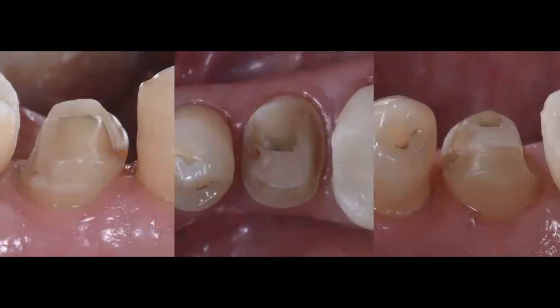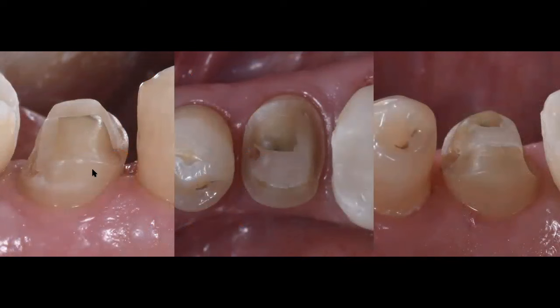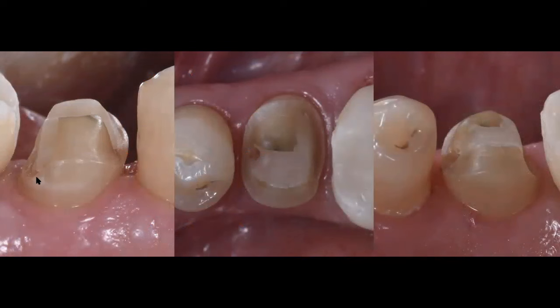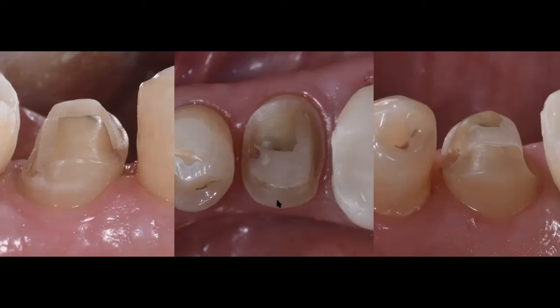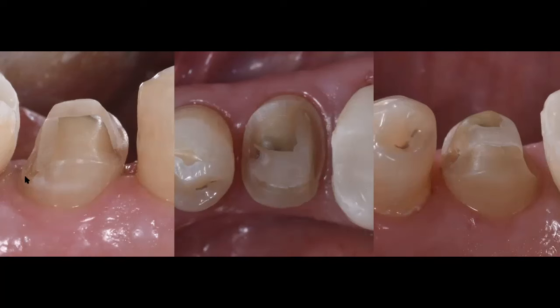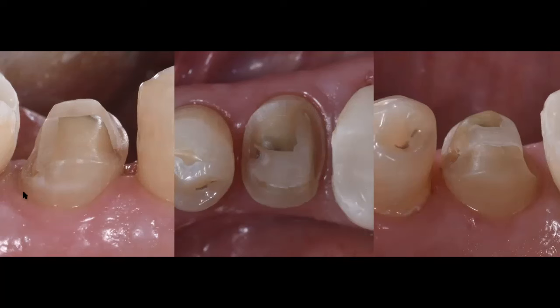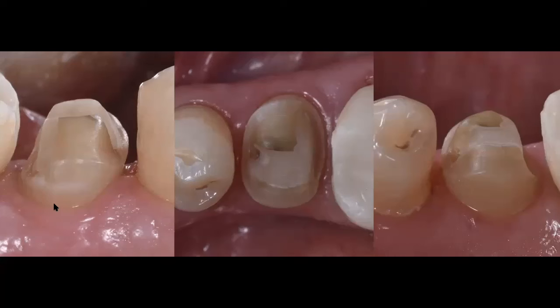You can see the peripheral enamel 360 degrees around the preparation immediately after tooth prep and rubber dam removal. The enamel follows the actual lesion with nice round line angles. Even though my distal margin is deep, it is above the gingival margin — it's a reachable margin. I can displace tissue with cord, use rubber dam, and access that enamel with phosphoric acid. That is the best-case scenario whenever possible.